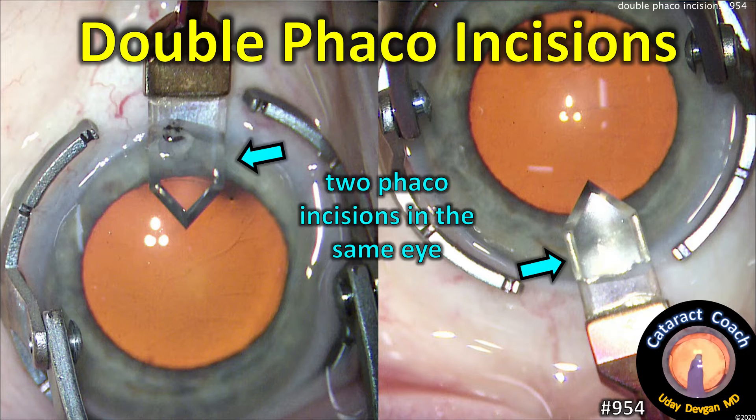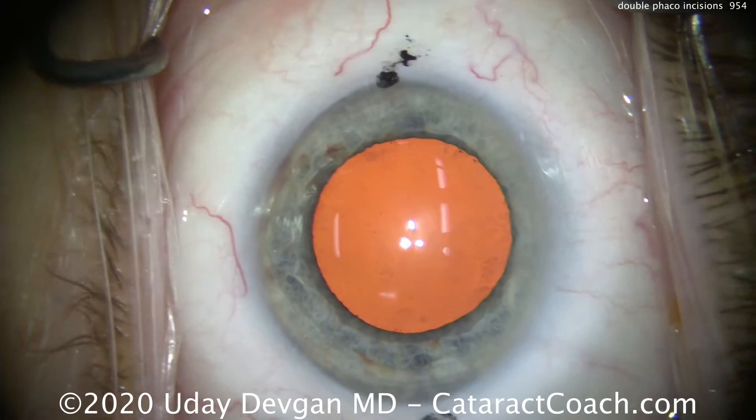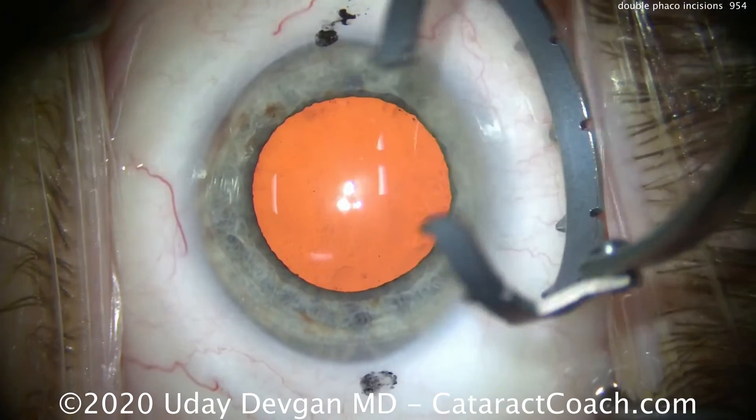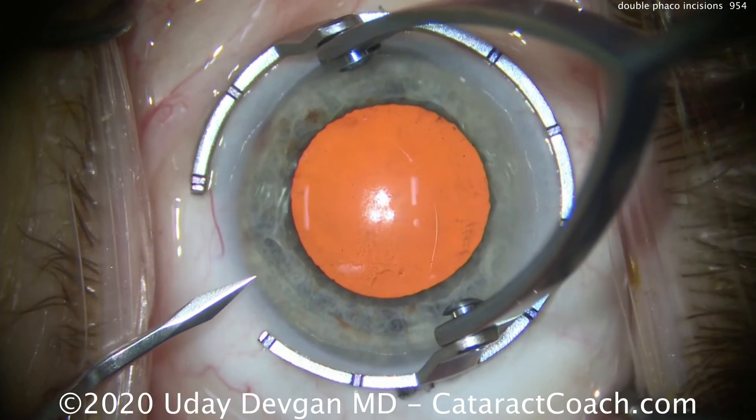Cataractcoach.com — double phaco incisions means making two phaco incisions in the same eye opposite each other. The reason is for treatment of astigmatism. This is a patient having routine cataract surgery; we'll make the paracentesis here.